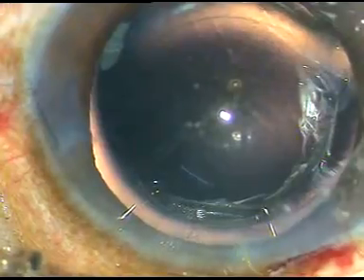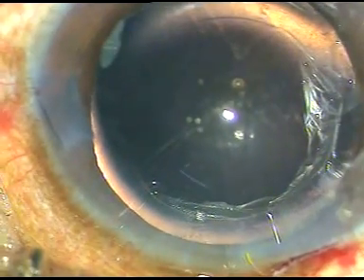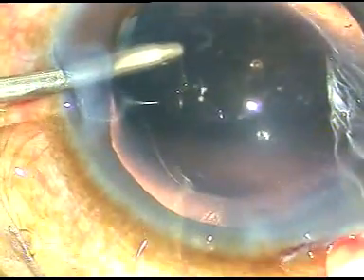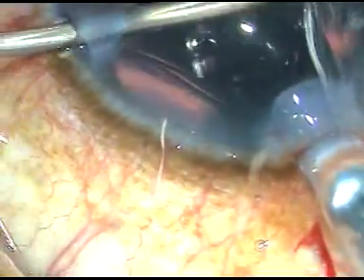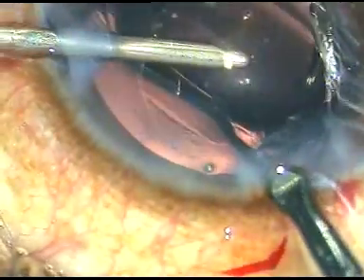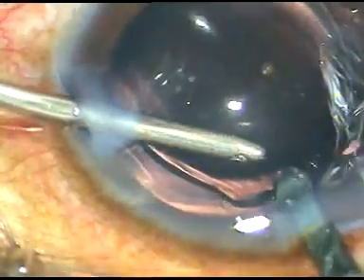Now, in this case, I am going to implant a hydrophilic acrylic intraocular lens, and it is being implanted under irrigation. And in this case, the leading haptic somehow didn't go into the capsular bag. However, I push the trailing haptic into the capsular bag.